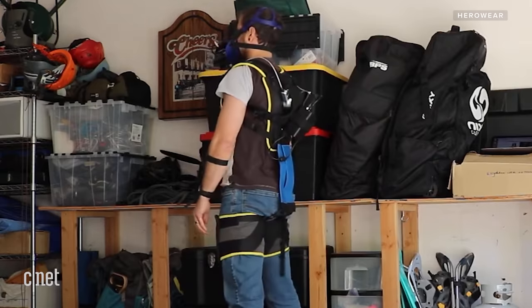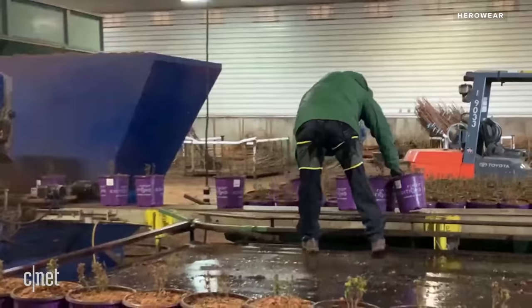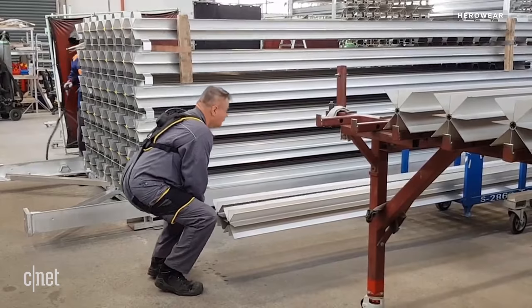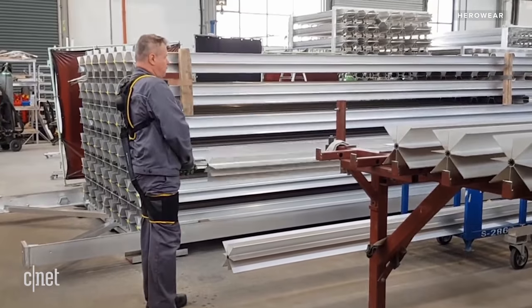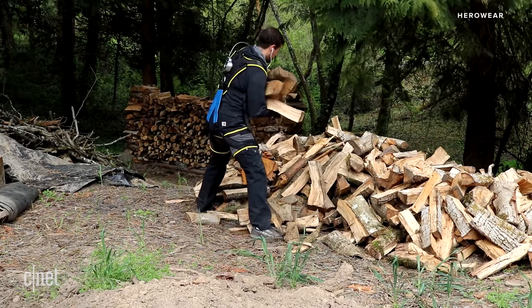This is the HeroWear Apex. It's a textile-based, non-powered exosuit designed to take strain off your back during repetitive motions. Think activities like warehouse work, where you're constantly moving boxes around, or even agricultural work, where you might spend most of the day in a crouched position. You've probably noticed this suit does not look quite as flashy as some of the other exosuits we've seen.